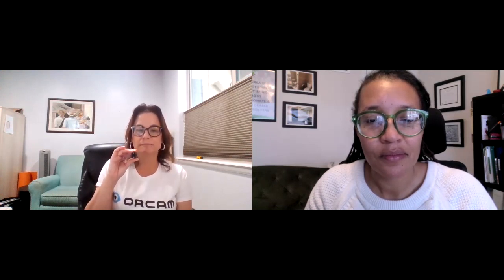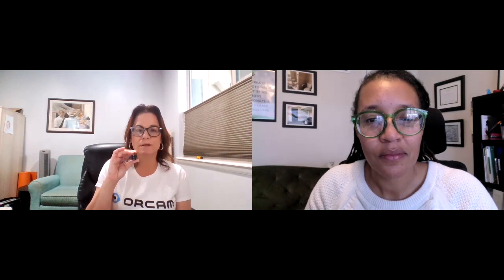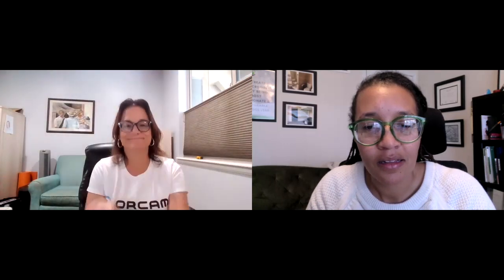Let's try it. Okay. So I'm going to say, hey, OrCam, start face learning. Please name the person in front of you after the beep. Dr. Brandy, confirm. Okay. We have learned you. Okay. Now I'm going to see if it recognizes you. Dr. Brandy. Wow, that was quick and easy. So it even learned my face from a screen.